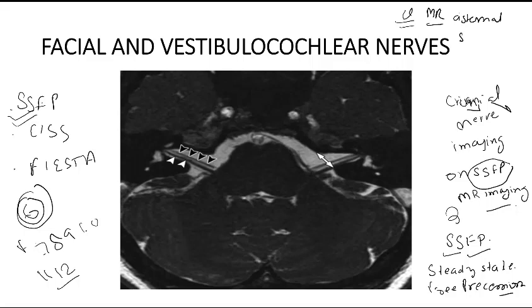The cisternal segments are very important for some pathological diagnoses, like trigeminal neuralgia, where you want to see whether any artery is abutting or indenting these cranial nerves and causing the symptoms. So we need to visualize the cisternal segments of these nerves and see how they relate to arteries, or whether there is any pathology in that segment. That's why this SSFP sequence came into the picture.